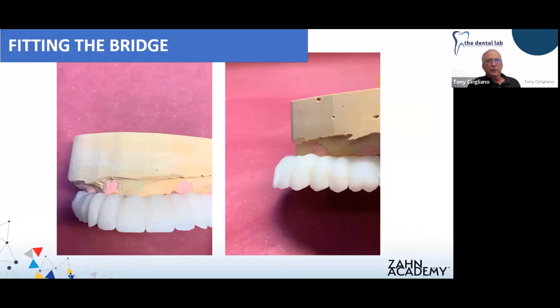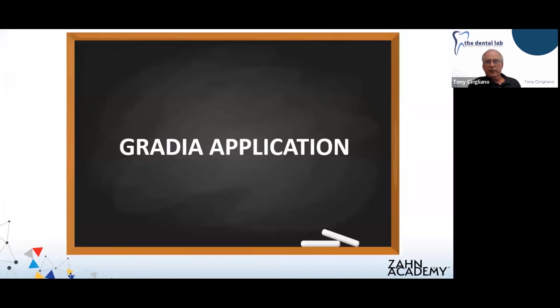Here is our bridge fitted to the model. You shouldn't have to do much work here, but make sure there's no binding in the soft tissue areas — the bridge gets fully seated, any points are relieved if needed, and we're ready to go.